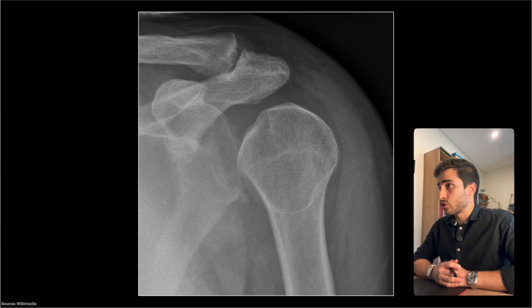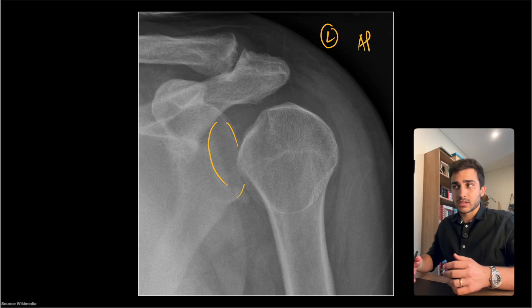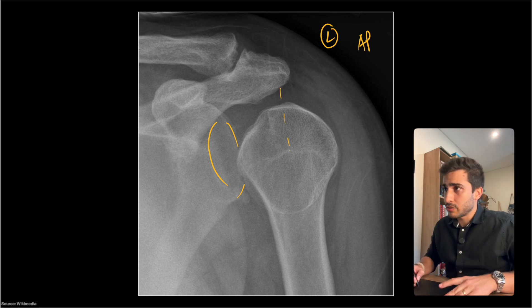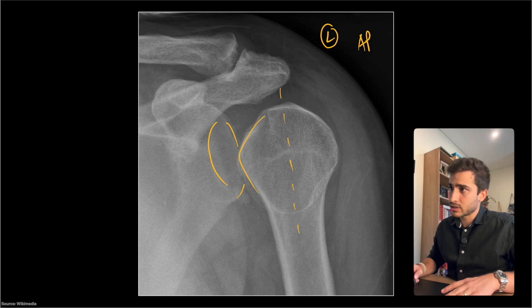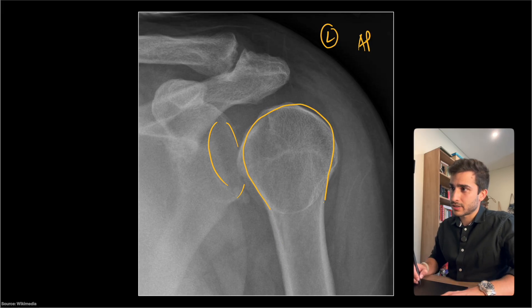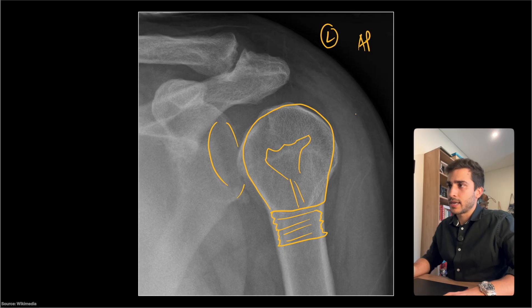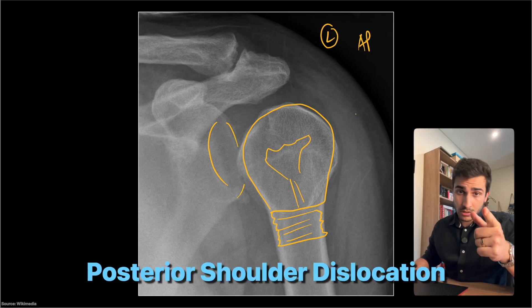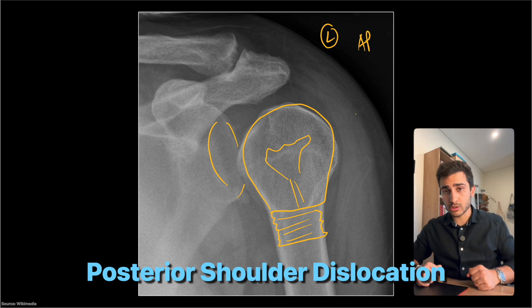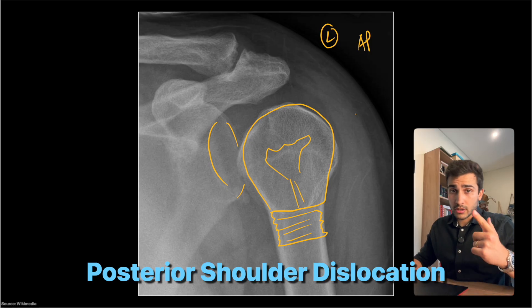Case three — this is the left shoulder, an AP shot. We can see the glenoid fossa here. If you look at the humeral head, it doesn't really look like a P or Q — if you draw a line through it, it looks symmetrical. This is what the light bulb sign looks like. So this is a posterior shoulder dislocation, because the mechanism of injury was adduction and internal rotation — if you push that to the nth degree, your shoulder feels like it's pushing backwards.